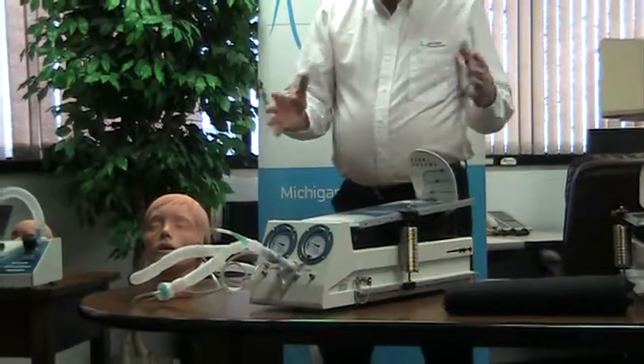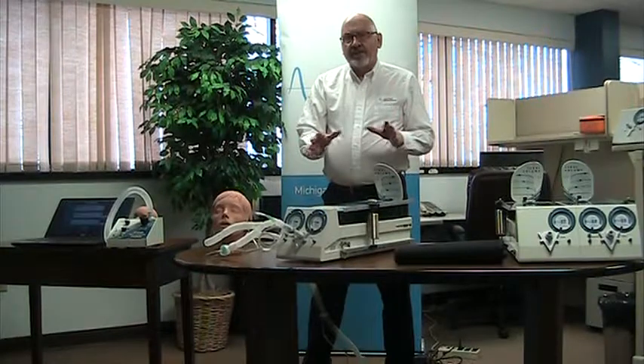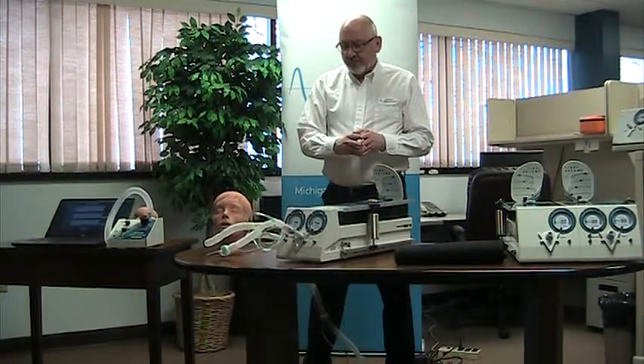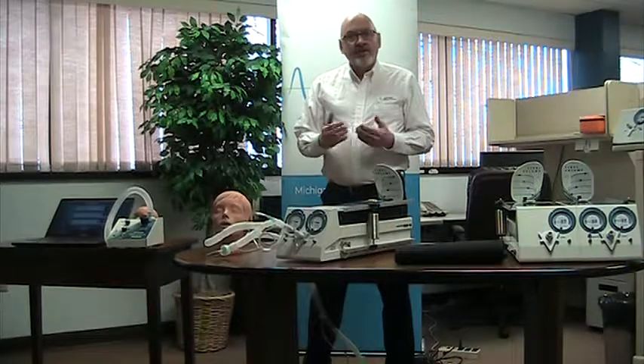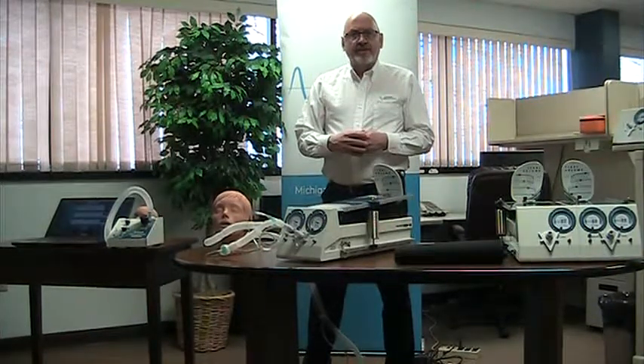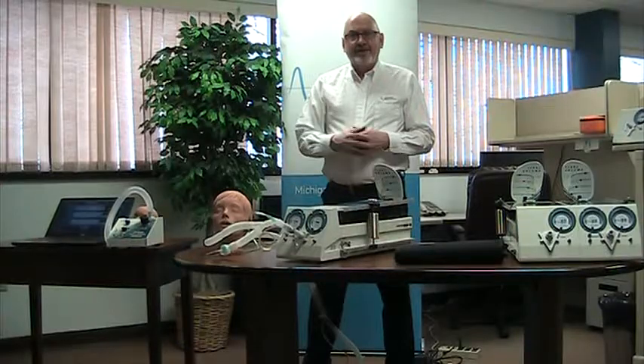So that's just a basic overview of what it is we're simulating and how we do that. If you have other questions, we invite you to contact Michigan Instruments or to visit our website at www.MichiganInstruments.com. Thanks again for your time.